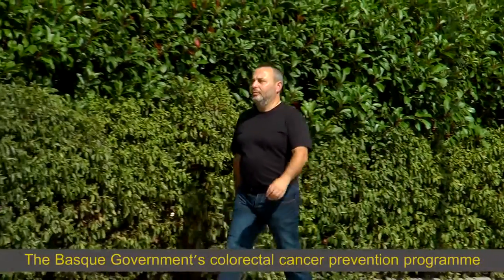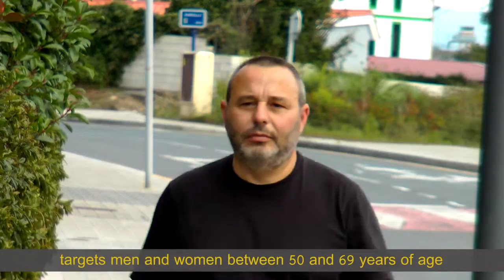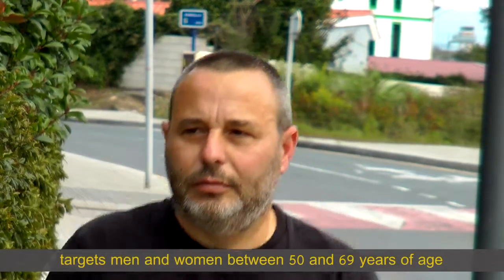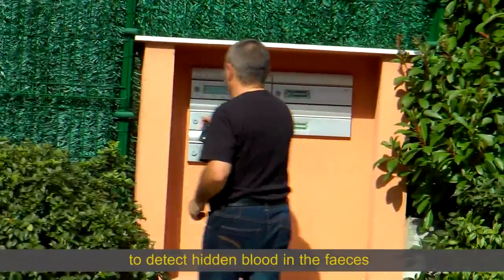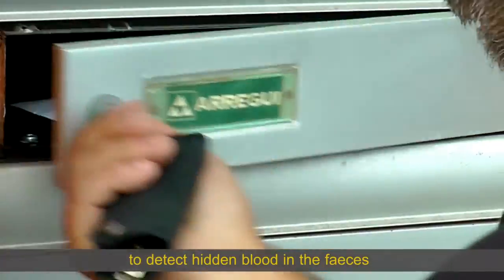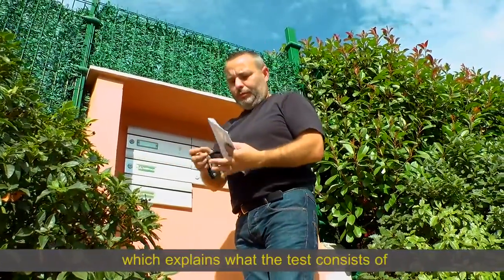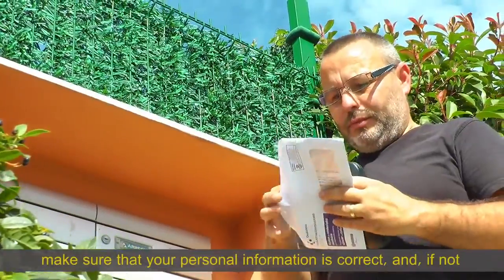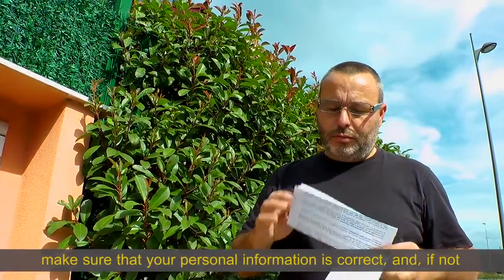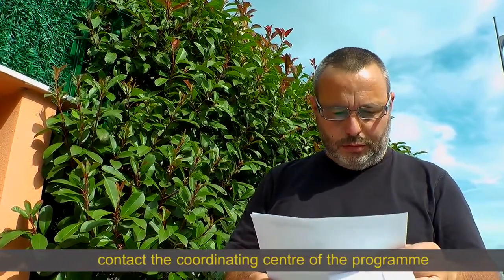The Basque Government's Colorectal Cancer Prevention Programme targets men and women between 50 and 69 years of age, with screening every two years to detect hidden blood in the faeces. A letter will be sent to your home which explains what the test consists of. Make sure that your personal information is correct and if not, contact the coordinating centre of the programme.